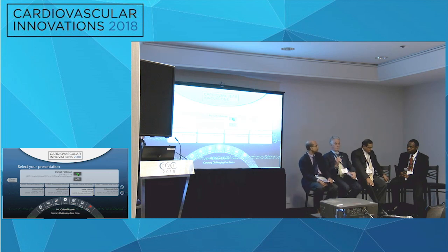We tend to address the coronary disease first. That's our usual approach. But you're right, Manish, there's a lot of different ways of going about it, and there are arguments in both directions. Quick question, what was his aortic valve area estimated to be? 0.95. 0.95, yeah. The reason I ask is we all know that AS is the thinnest ice to go out dancing on.